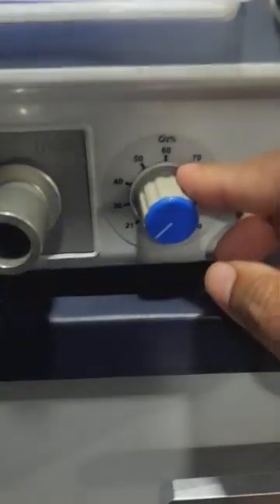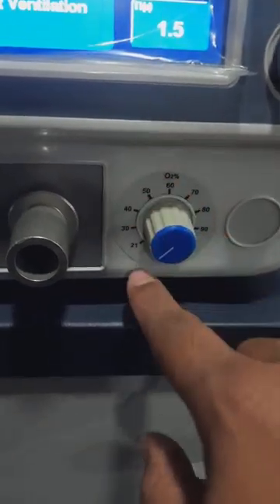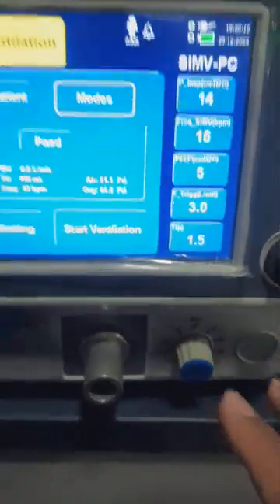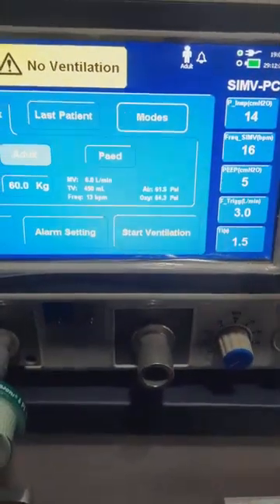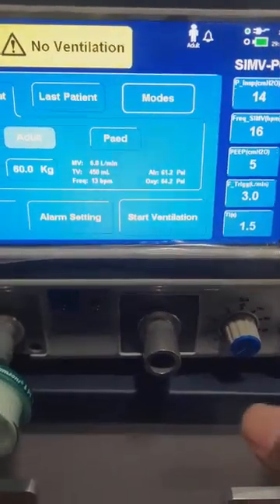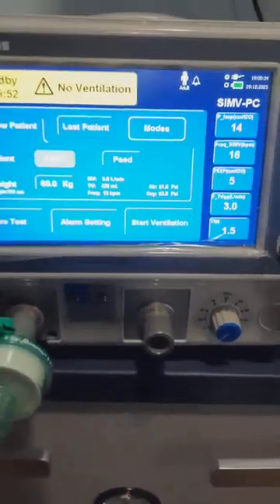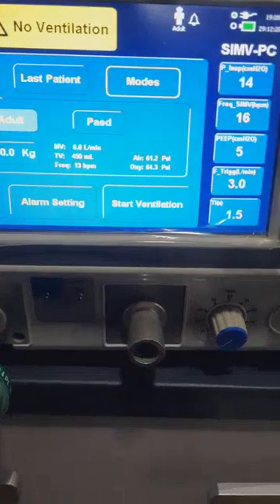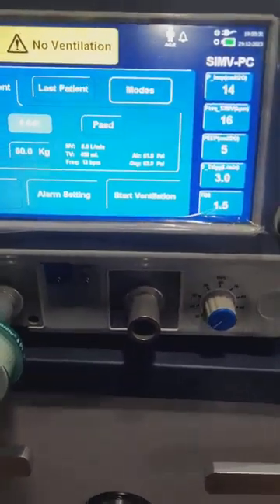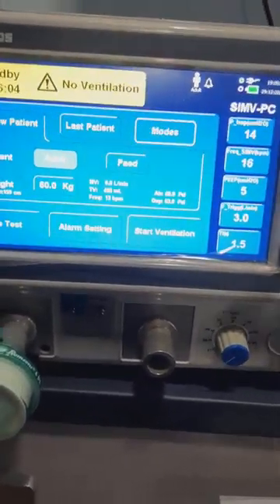The FiO2 starts from 21% up to 100%. It starts from 21% and not zero percent because the normal air we breathe already contains 21% oxygen — it does not contain zero percent. So even if we are not supplementing with extra oxygen from the oxygen inlet, the ventilator will still deliver 21% oxygen to the patient. If the patient requires more oxygen, we supplement it by blending additional oxygen into the air.